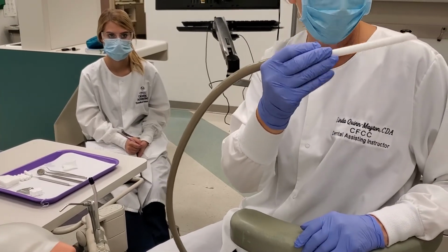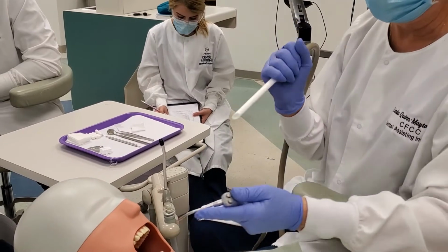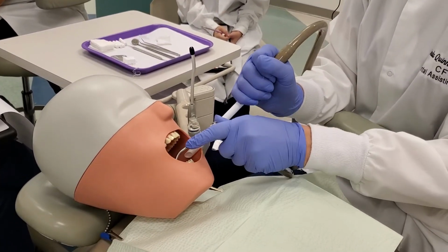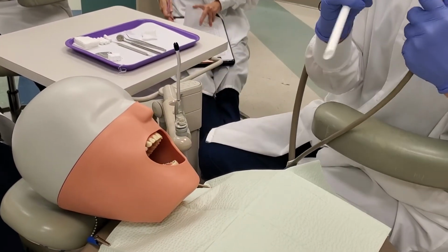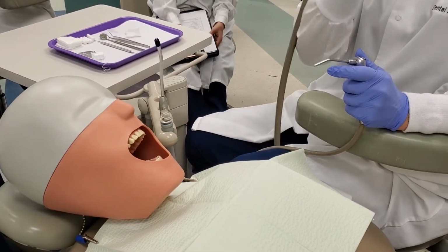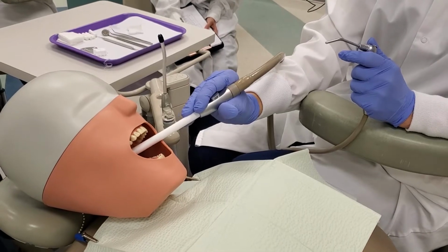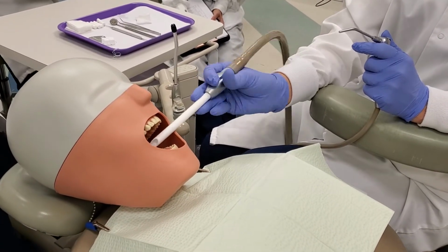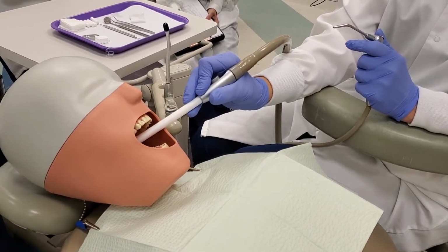So when you're using retraction, which is going to be upper left, lower right, you'll be retracting. The only time you'll have the pen grasp is when you're in the upper right, because you don't have anything to retract. You're just right here, okay? Or if you're in anterior, upper anterior, okay? But the only time you use the pen grasp is in your upper right.